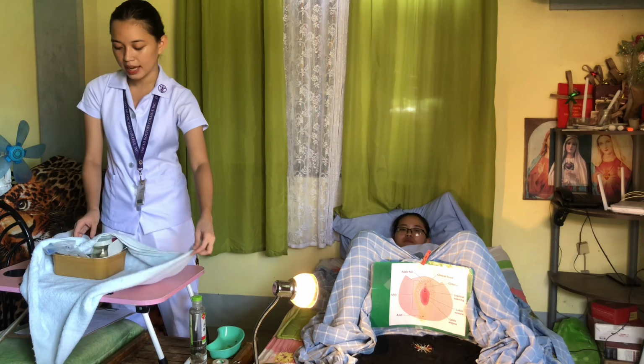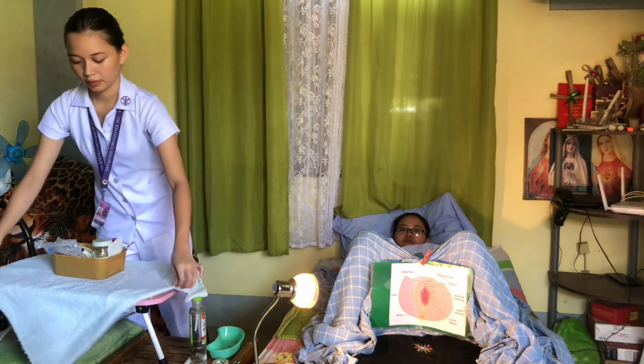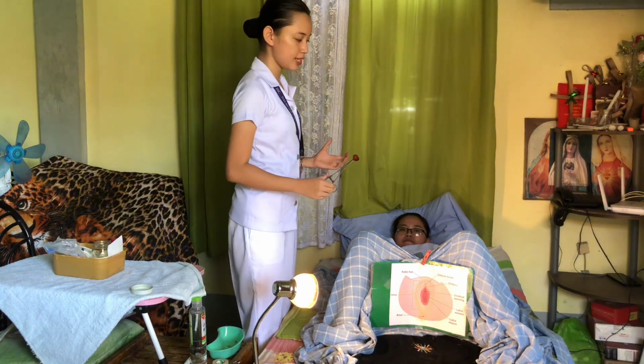Next, I am going to open my tray set and arrange the equipment accordingly. This is for convenience and to maintain the sterility of the equipment. After doing that, I am going to use the sterile forceps to pick up some cotton balls that are soaked in a cleansing solution to clean the genital area of our patient. Thorough cleaning of the meatus and the area surrounding it reduces possible introduction of microorganisms in the bladder.